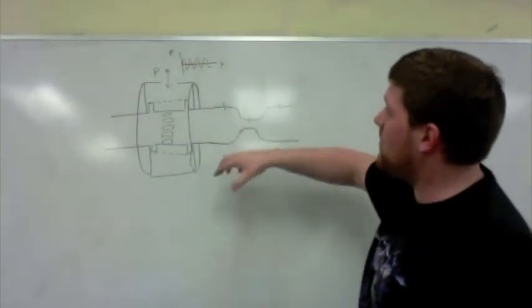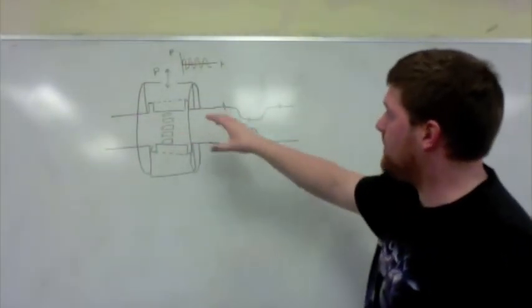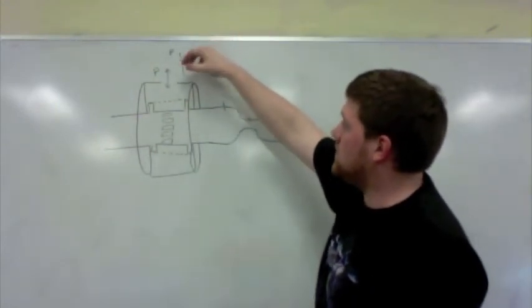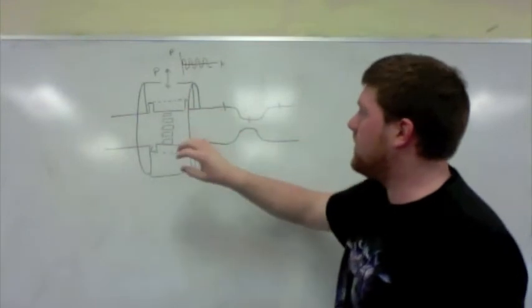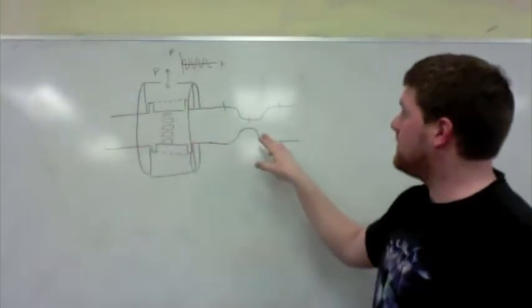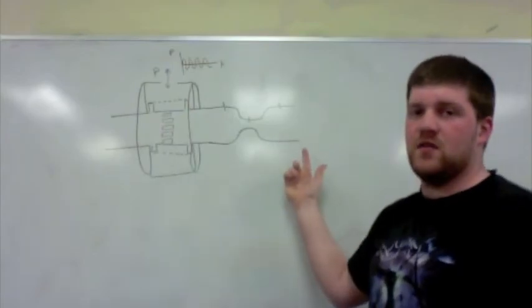Alright, so here's how we plan on inputting pressure oscillations while maintaining a sterile environment for the patient. So we have an outer chamber surrounding a flexible membrane. With the outer chamber, we input pressure oscillations, and through the flexible membrane, maintaining a sterile boundary, the pressure is input into the flow, which we use to then take our measurements.